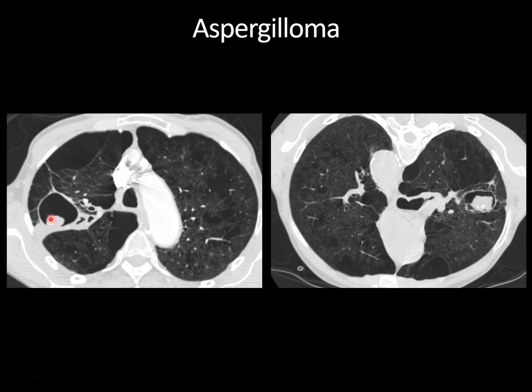This appearance of a solid nodule with surrounding gas is known as the Monod sign — M-O-N-O-D — which describes the gas surrounding the fungus ball in a cavity. Technically, that's different from the air crescent sign, which you see in patients recovering from angioinvasive aspergillosis. Some sources use these terms interchangeably, and I'll leave it up to you to decide how much of an academic battle you want to get into with your colleagues about the nomenclature of aspergillosis.